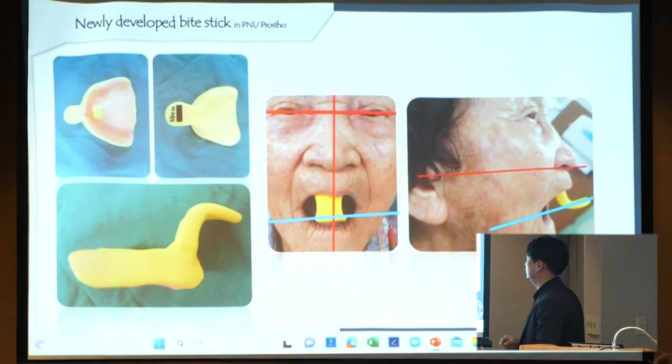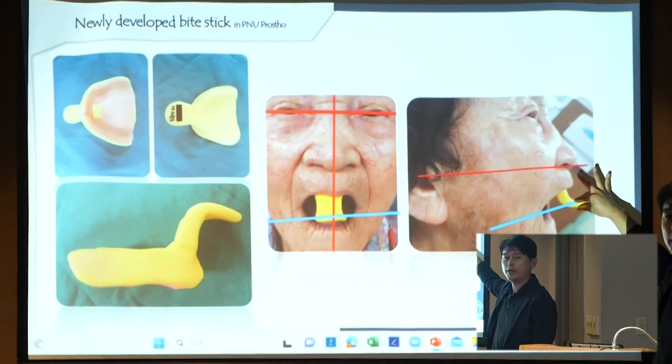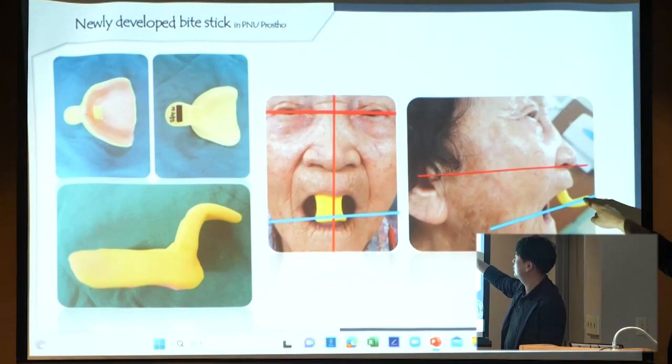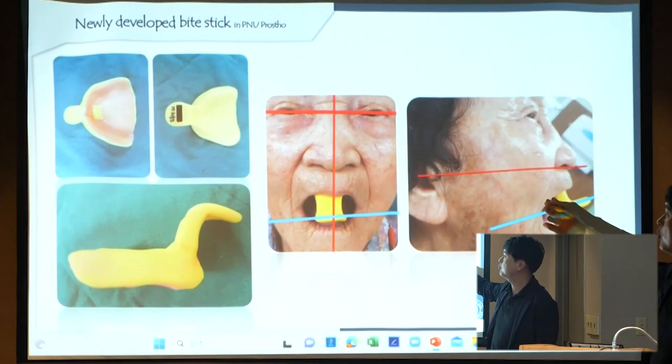So you have to know the role of the tray handle. The tray handle indicates the occlusal plane. When you insert this tray, the tray handle has to be parallel with the interpupillary line, and when you see the lateral side, the handle has to be parallel with the camper's line. This is best, but oral hygienists don't have enough time to position the tray in the proper intraoral position, right?